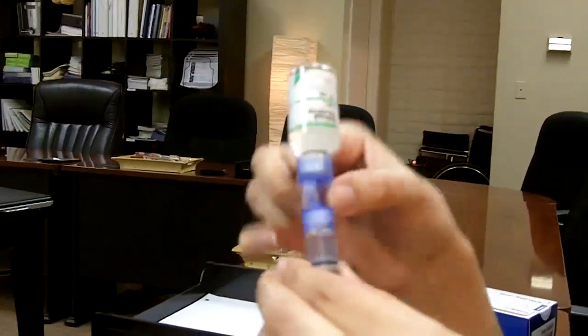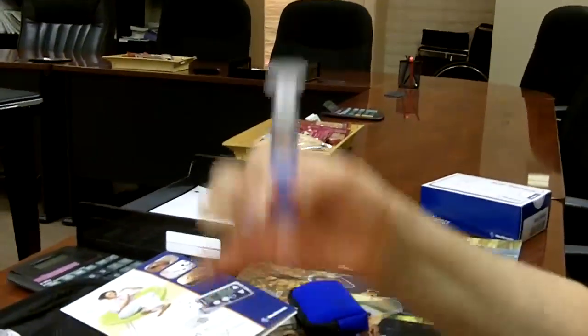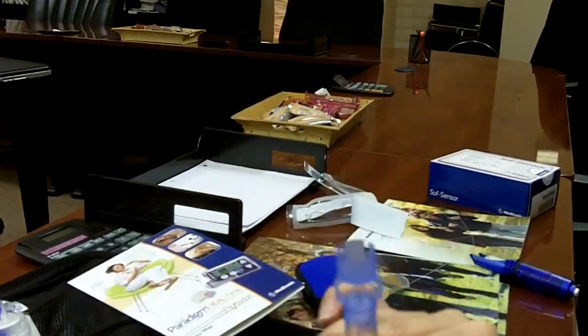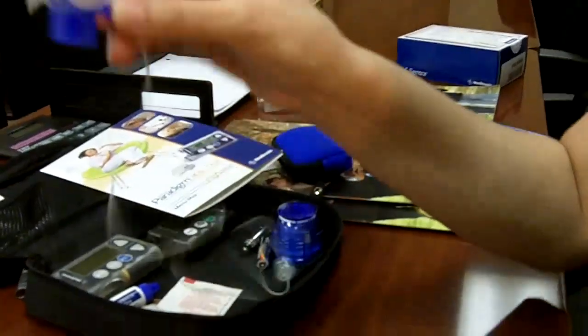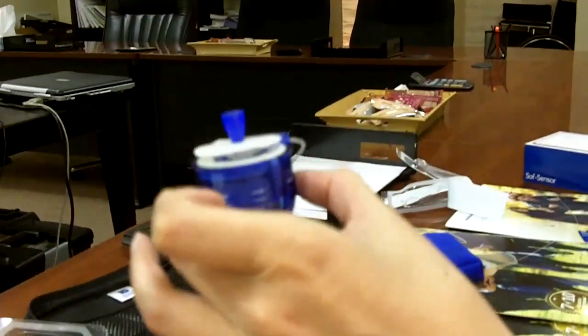I like to take it kind of like a level to make sure — oh, see, got a big bubble there. I'll just push it really high up. This flips back over. Sometimes I'll even just curl a little bit out the top like this. This twists out the back, and then we have our little reservoir. Hold it like a teacup, the way they say. And this is called a serter device — this is going to help the patient insert it under their skin.